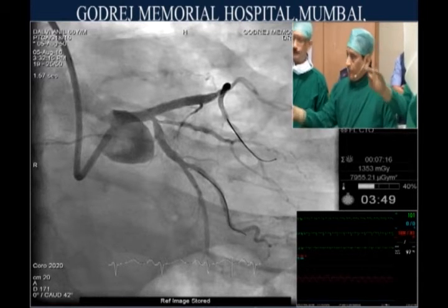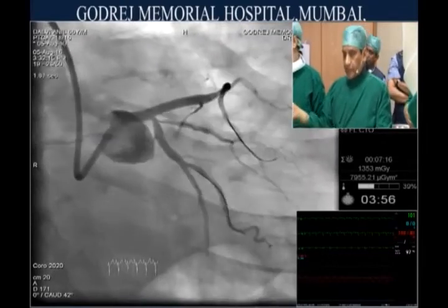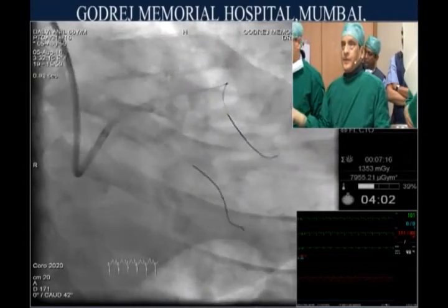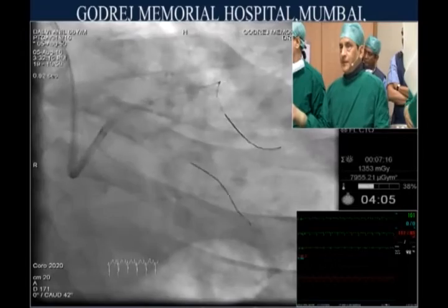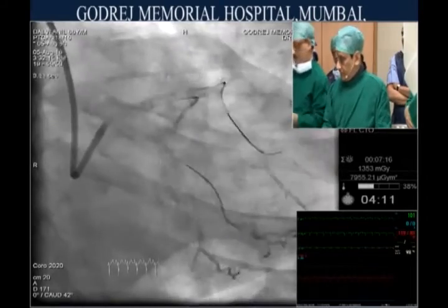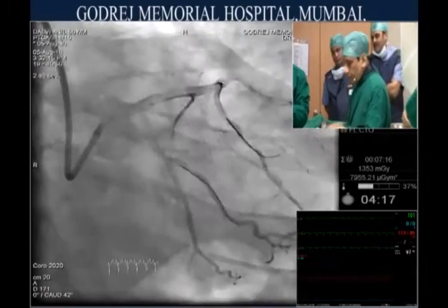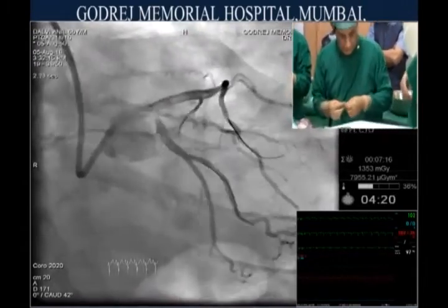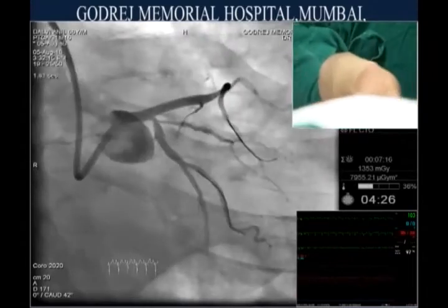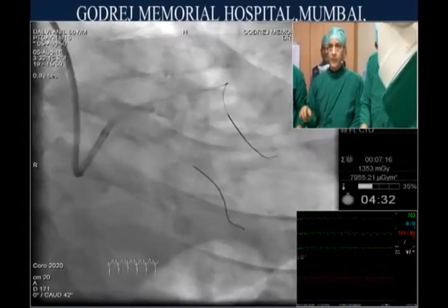Get a 4.5mm balloon. The circumflex was about 30 percent before, now maybe 50 percent. The rest of the vessel looks perfect — septals remain nicely, diagonals all good, no pinch. We have a 4.5 by 10mm Apollo balloon — it's a French company. This 4.5 by 10mm balloon will be used for the proximal left main.